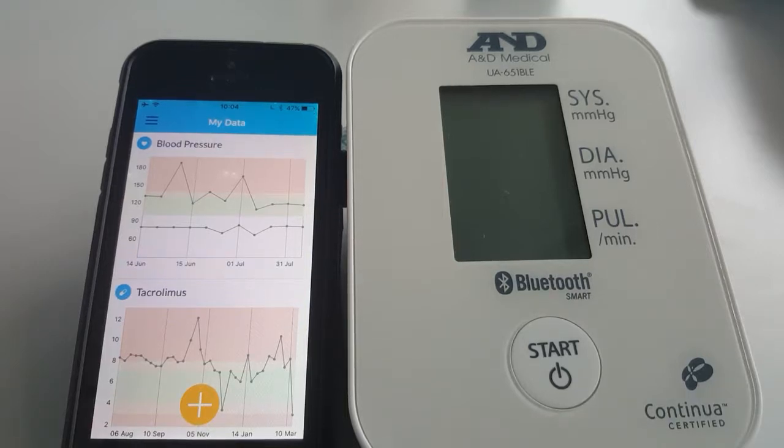This video describes how to take blood pressure readings on the Patient Empower app. Please ensure your monitor is paired first. Rest for a few minutes before taking a reading and ensure the cuff is fitted correctly.